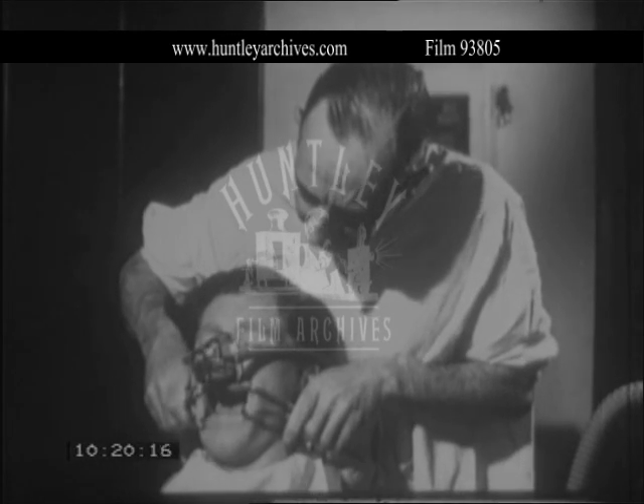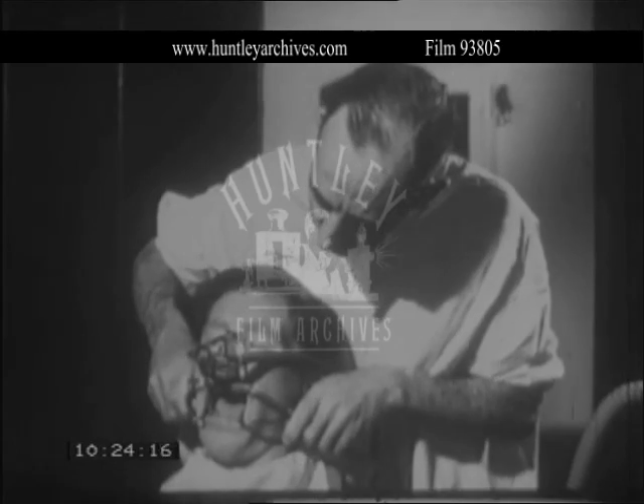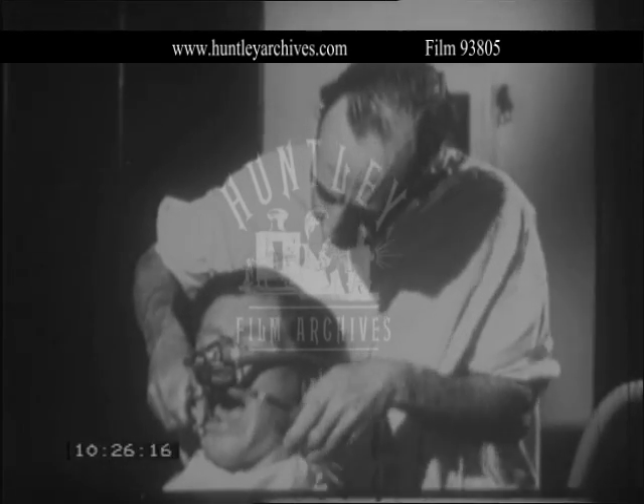The stimulus of opening the mouth will upset the smooth anesthesia. You must therefore ask the dental surgeon to wait until the patient has settled down.